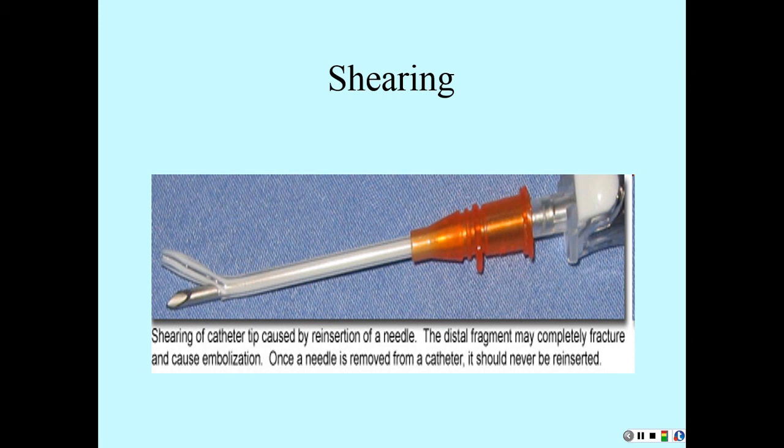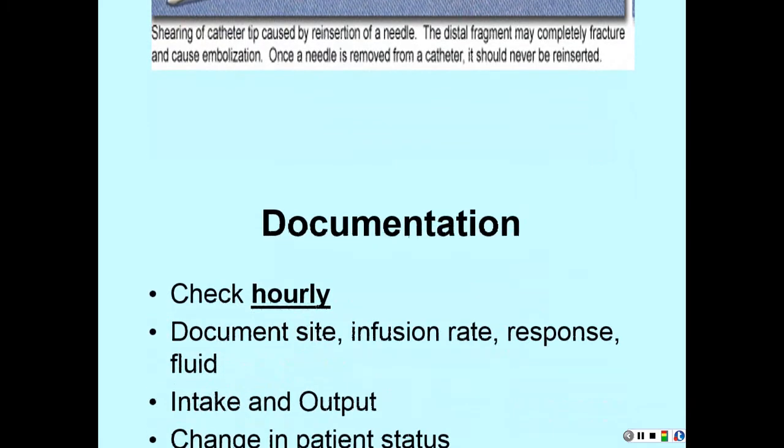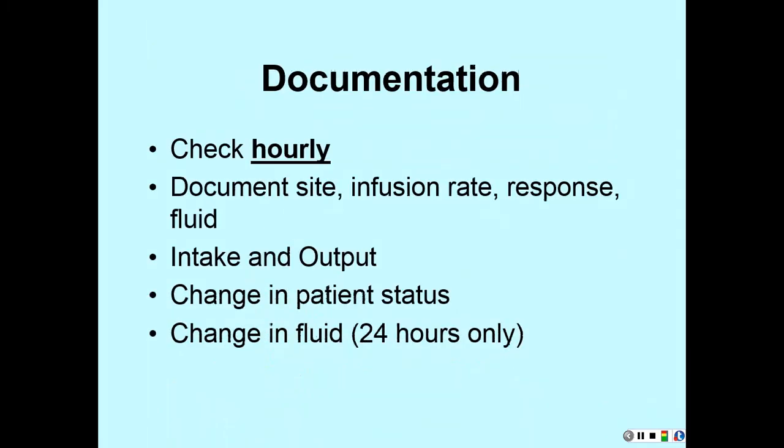So aseptic technique, you've got to clean that site, and then you've got to stay off of that site, and that'll be the thing when you guys are checking off. That'll be the thing that you'll have the most problems with. You'll want to get all up in there. Okay, so just watch that. Be aware of that. All right, when we're documenting IV therapy, IVs really should be checked every hour.